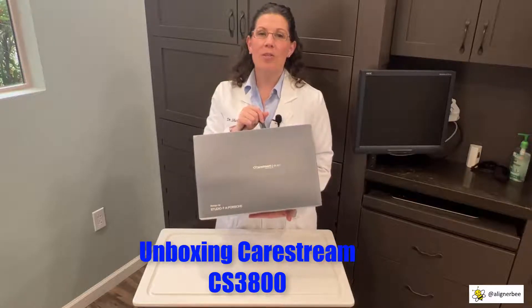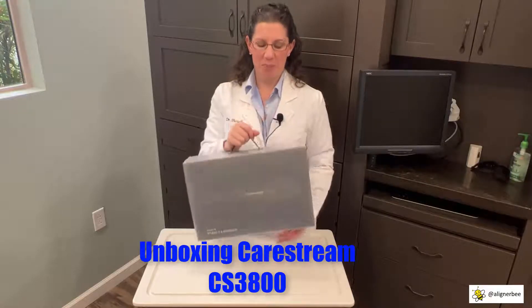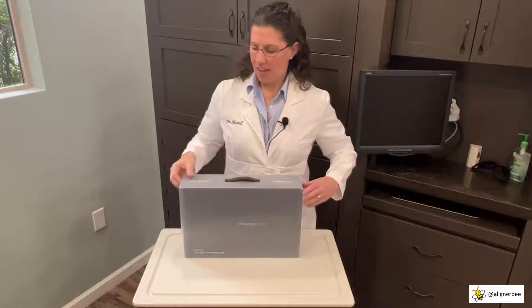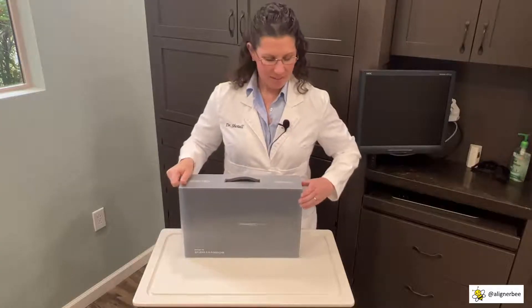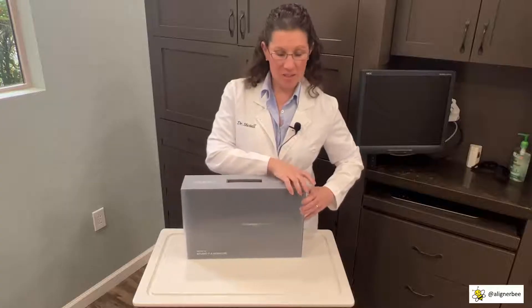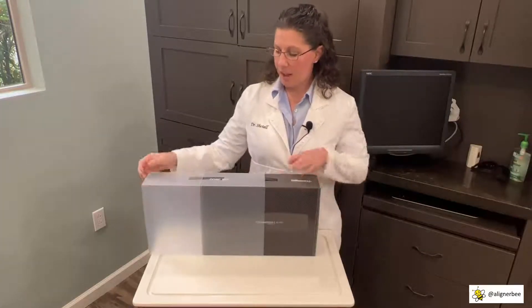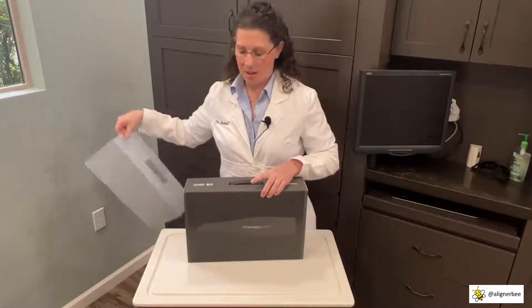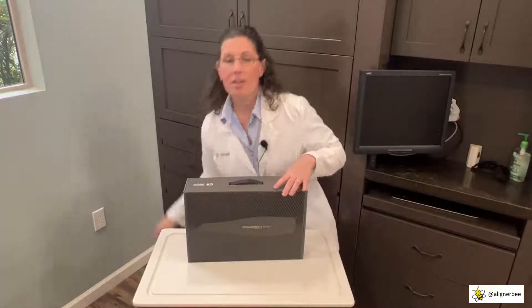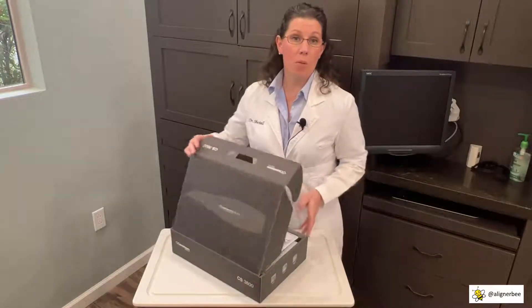Let's go ahead and open our new CareStream CS3800 and see everything that's included with the intraoral scanner. I want to make sure I take everything out of the box carefully, because I always like to save the boxes that my intraoral scanners come in so I can use them for storage or if I have a mobile office.